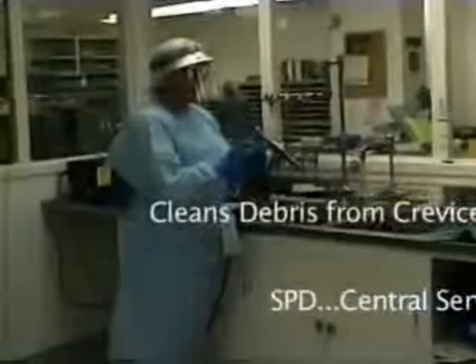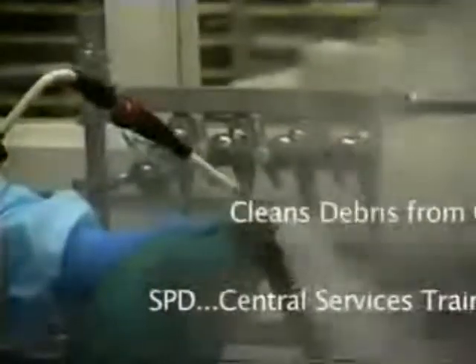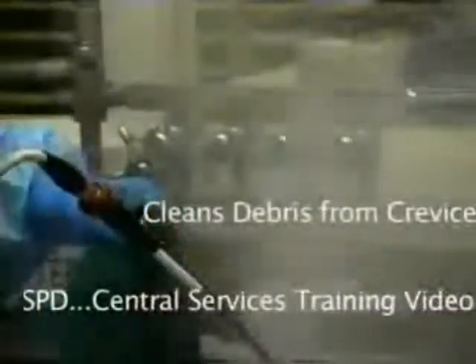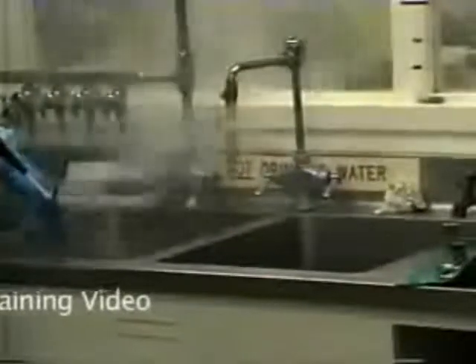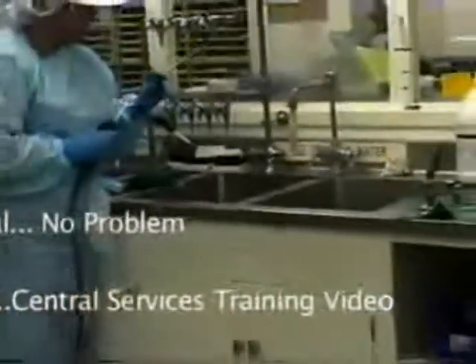The next item we're going to do — the sternal spreader oftentimes gets debris down in these crevices and also down in the blades. Down within the grooves, as you can see, the difference between getting that extra burst of steam and getting that cleaned down in there removes the gross contaminant. This was a severely rusted instrument.